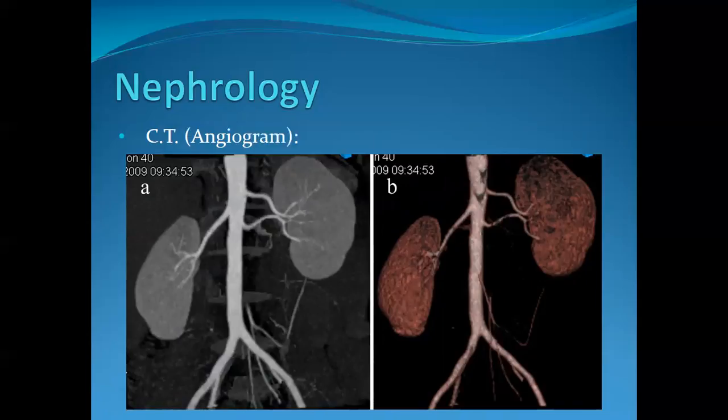The good thing with a lot of MR angio compared to CT angio is we don't have to give contrast a lot of the times with the MR angio. So if you have a person with severe renal insufficiency or potentially with bad allergic reactions to the CT dye, then MR angio is a good test of choice to go to. And you can always talk to your MR techs and see if they can do those 3D time of flights, which is how we evaluate for vasculature with MR. And they may not actually have to give contrast to evaluate the vasculature. So MR is also an option you can do for angiograms throughout the body.